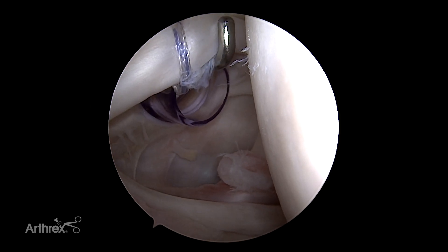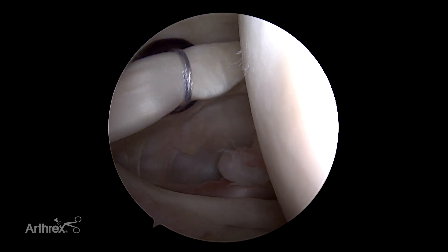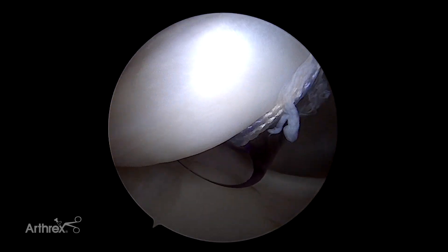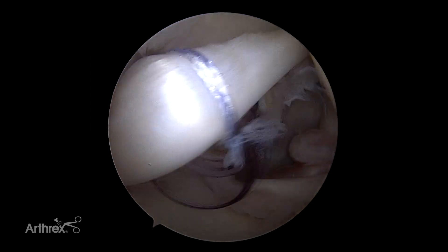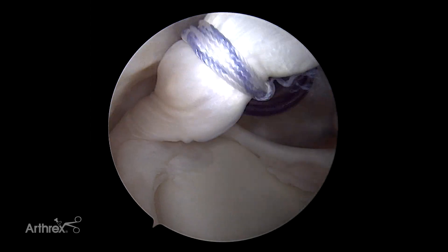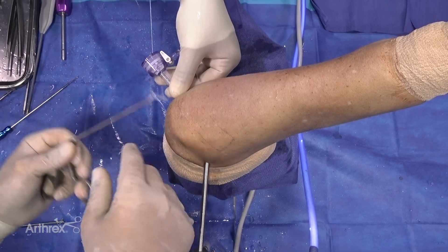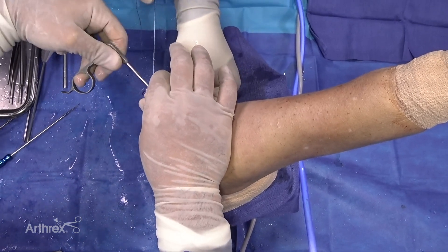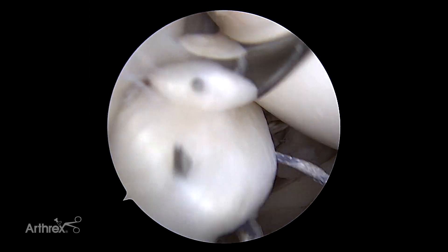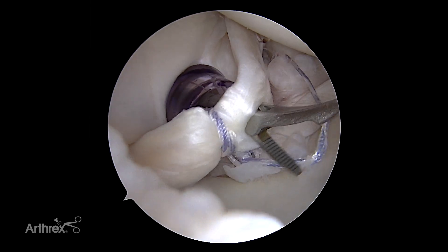If you want to replicate the tension closer to the native tension of the biceps, you are actually going to put the loop further down. The one thing about putting it further down is you will have less biceps left distally in order to create your tack. I prefer to take the biceps slightly off tension, so I'm going to use this cannula as a kind of a knot pusher to push my knot closer to the insertion of the biceps — and this is where my luggage tag is going to be created. At this stage we're going to reintroduce the suture from the suture tape fiber link by grasping it with the bird beak and reinserting it below the biceps. Once the suture has been dropped, we can use the tip of our bird beak to pierce through the center of the biceps and grasp any part of the suture to finish up our loop intact knot.